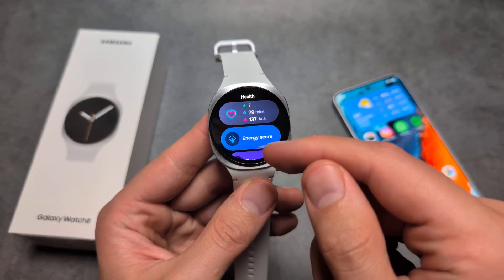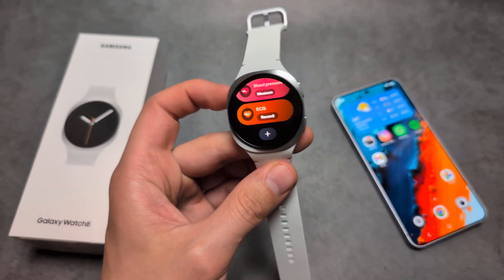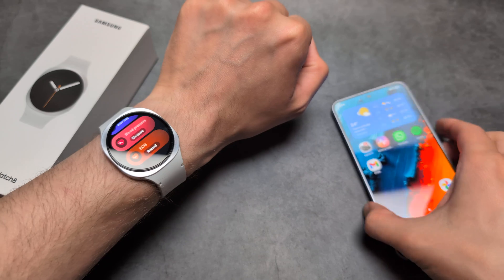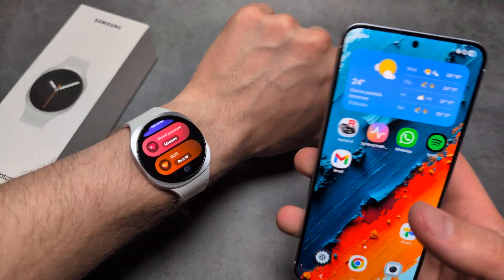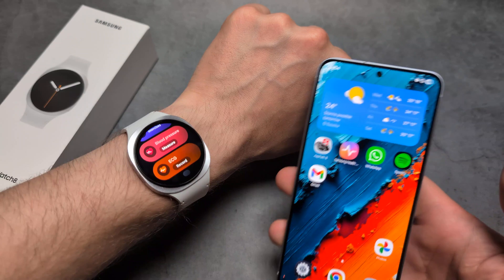If you want to measure it, over here you can see you have your ECG. Let me actually wear the watch. The first time you start this, you will be asked to open up your phone app and confirm that you are familiar with this feature and agree to the terms.